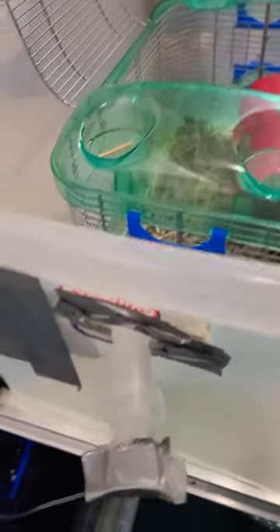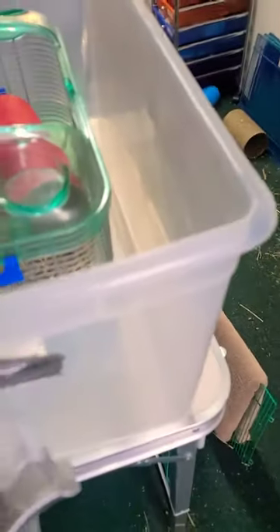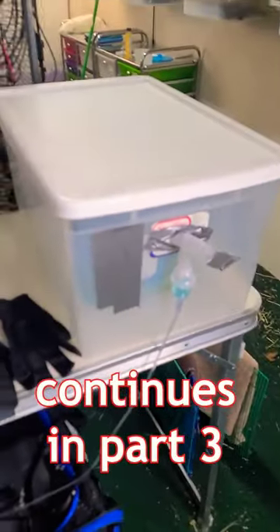Replace the mouthpiece when it gets dirty to clean well. I'm ready for the next time — I have to do it properly every day. This is my homemade DIY nebulizer chamber for the rats.